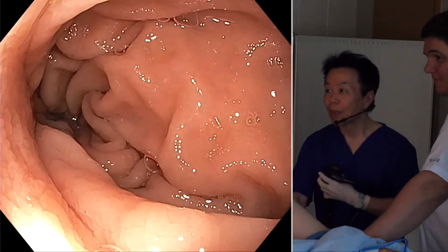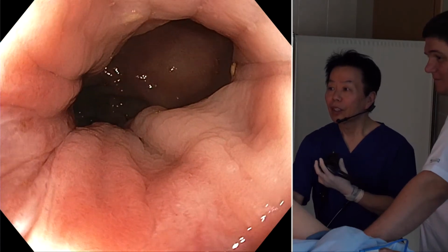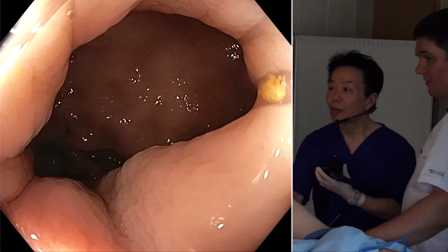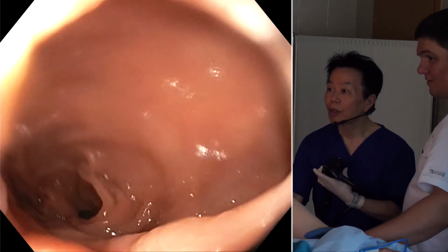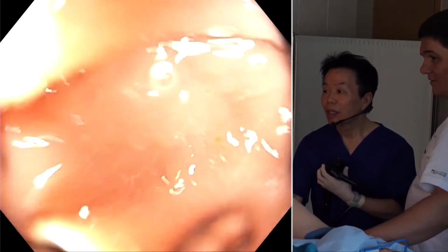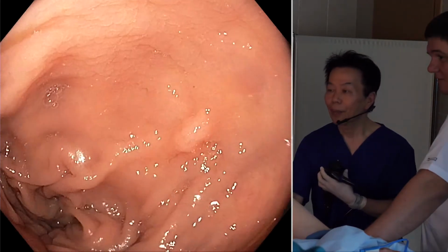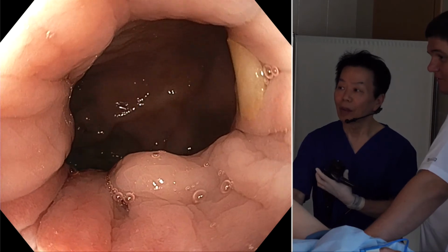In order to observe the anal canal, you should suck air like this. If you inflate too much, you cannot see the mucosa very well. If you inflate much air like this, some part of the mucosa will go behind the scope. So inflate and deflate. You should repeat something like this. With this deflation, you can observe almost all the surface of the rectum, even without retroflexion.